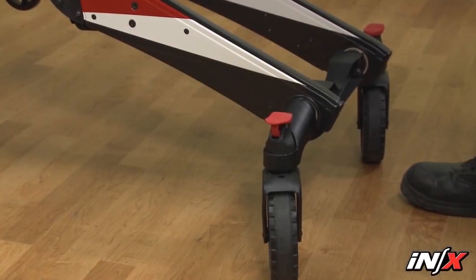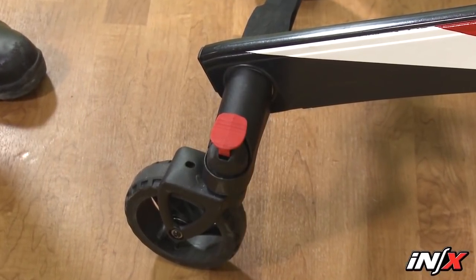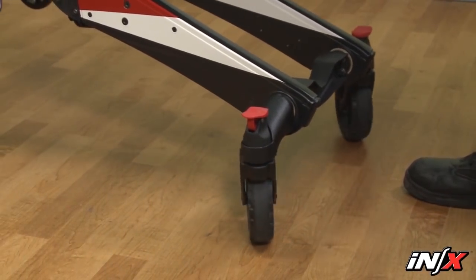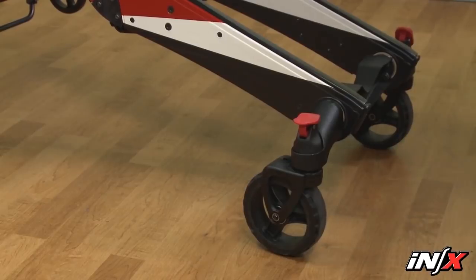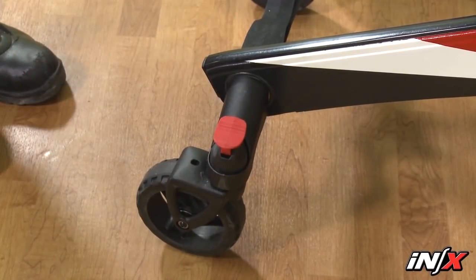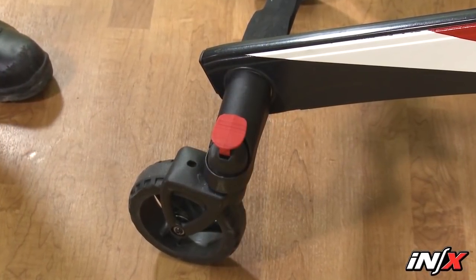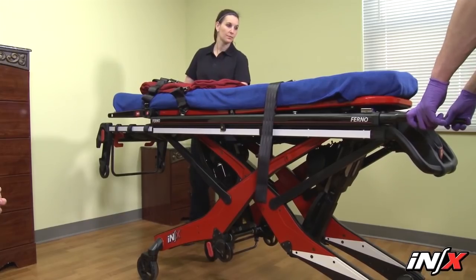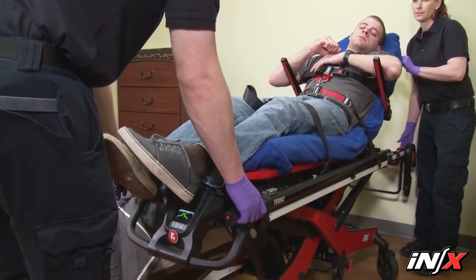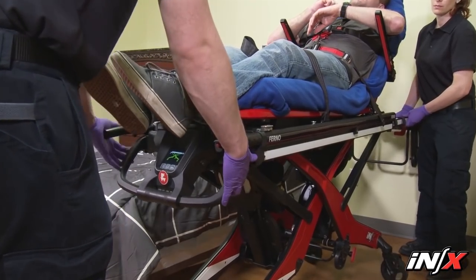There are two wheel locks to help keep the NX from rolling during patient transfer and certain medical procedures. They're attached to the control end transport wheels. Push the lock lever down to engage the lock and push the top of the lock lever to unlock. The lock stops the rotation of the wheel when engaged. They're not a substitute for operator control and should never be used to slow a moving NX. The operators must remain with the NX and keep control of it at all times. Do not leave the patient unattended.